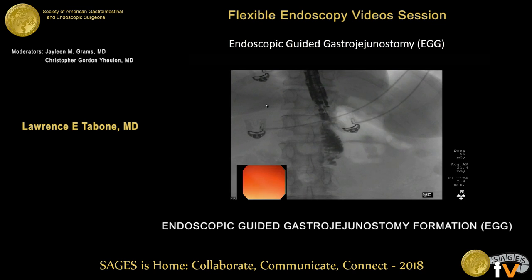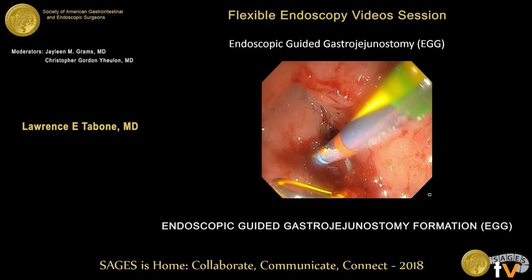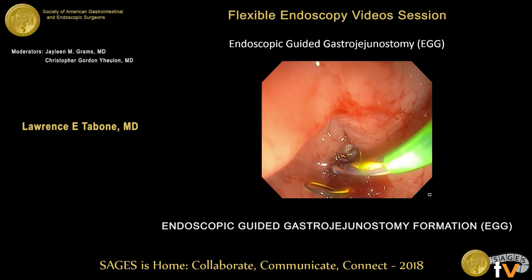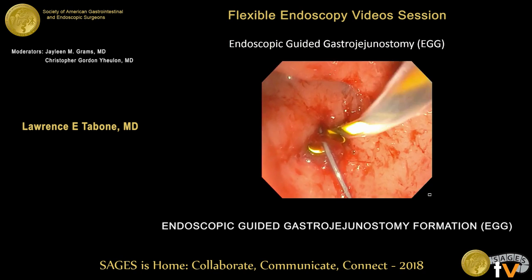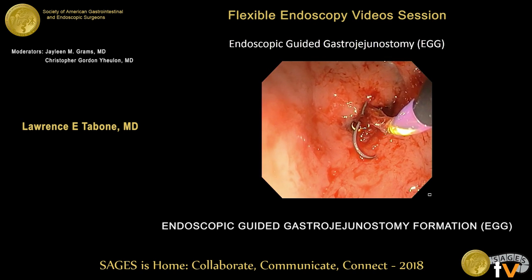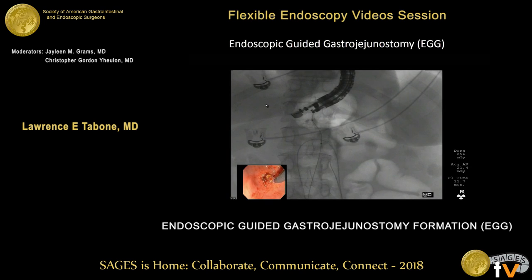We took a 0.035-inch J-wire and fed it through the 19-gauge needle under fluoroscopic guidance, confirming it was going into the jejunum. There was a slight redundancy or coiling of the wire, but we were able to advance it significantly. Once we established access into the jejunum, we used a through-the-scope endoscopic balloon dilator. The balloon catheter was advanced over the J-wire, and we dilated the track up to 10 millimeters to establish more open luminal access.